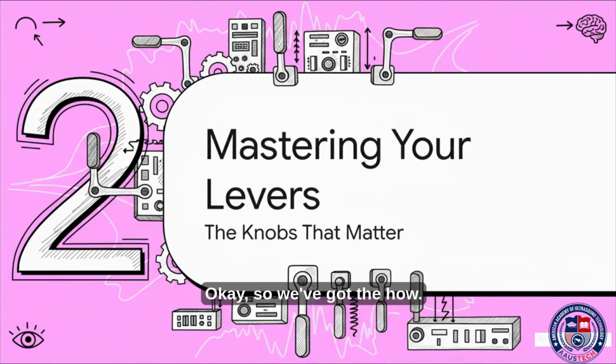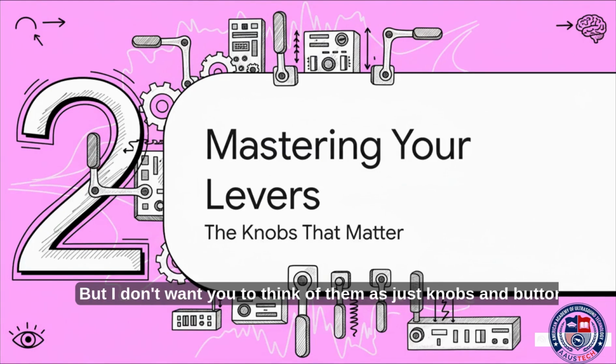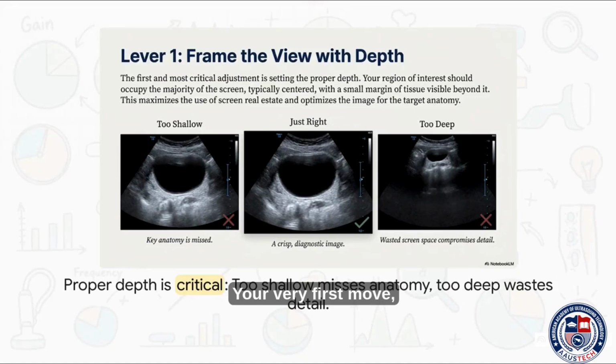Okay, so we've got the how. Now let's get our hands on the what. We're going to talk about the main controls you'll be using, but I don't want you to think of them as just knobs and buttons. Think of them as powerful levers that give you total command over the quality of your image. Your very first move, every single time you put a probe on a patient, should be setting the depth.